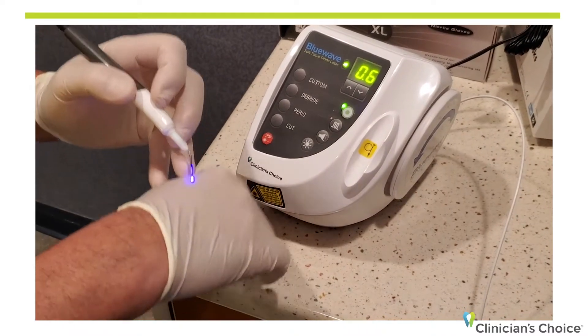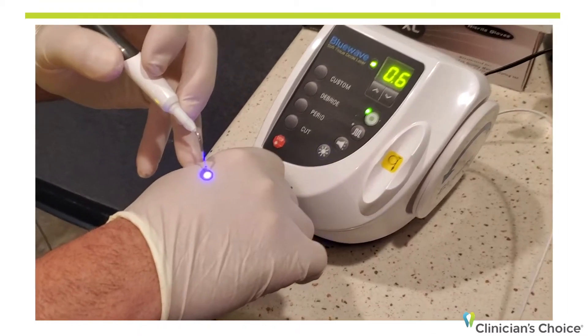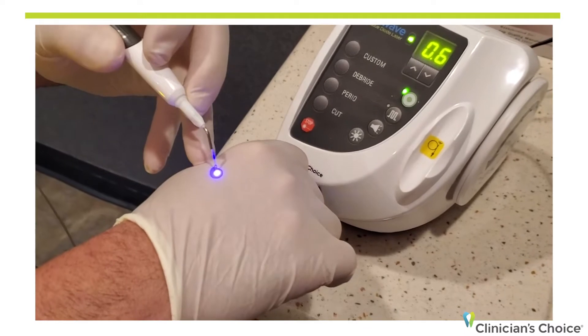First thing we're going to show you is there is a blue aiming beam, as you can see here on the glove, and that blue aiming beam — which will dissipate in the mouth a little bit — is your guide to cutting.